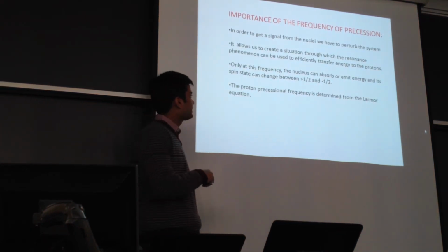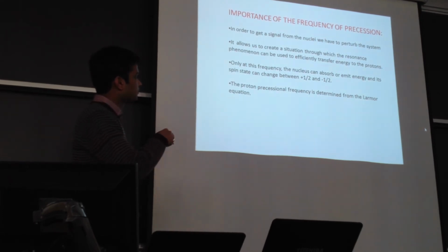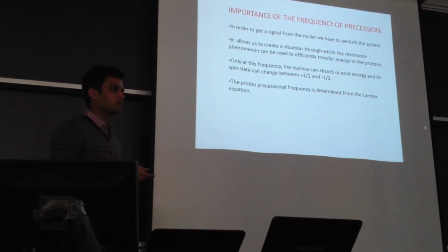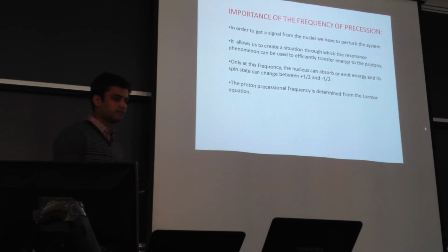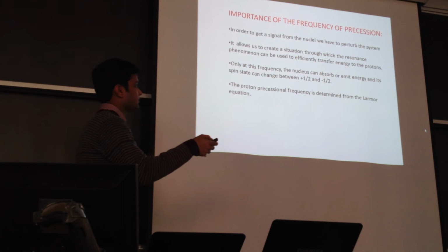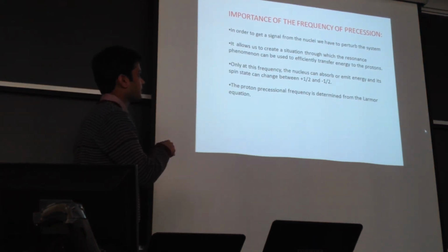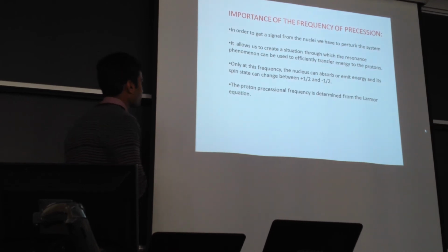It allows us to create a situation through which the resonance phenomenon can occur, and through which we can efficiently transfer the energy to the protons and record the response afterwards. And only at this frequency does the nucleus absorb or emit energy. So it's really important for the resonance phenomenon to occur.